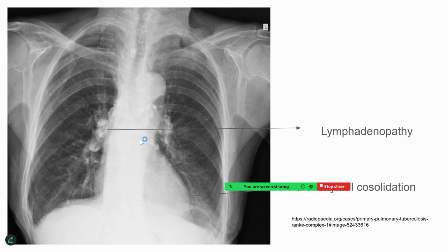Of course, to confirm whether it's really tubercular or not, you need other investigations like biopsy and so on. So it's not that you make the diagnosis of tuberculosis only with radiological evidence. A simple X-ray alone is not enough to diagnose tuberculosis, though it may give sufficient clue as well as some idea about the progression of the disease.